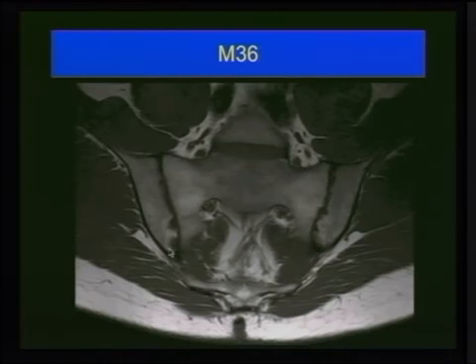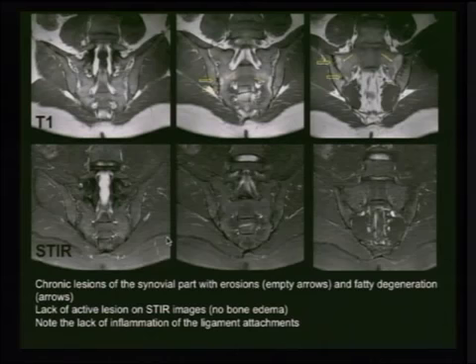So these are the erosions here. So you need to go more. Is there any associated edema or no edema? You go for the cases of the STIR imaging. This is a case which is really interesting.